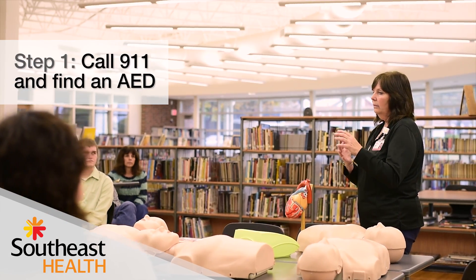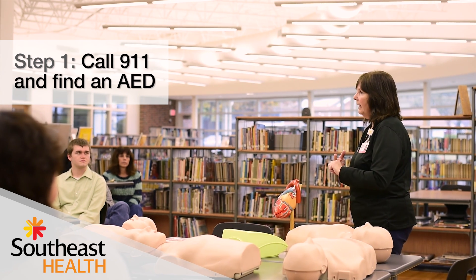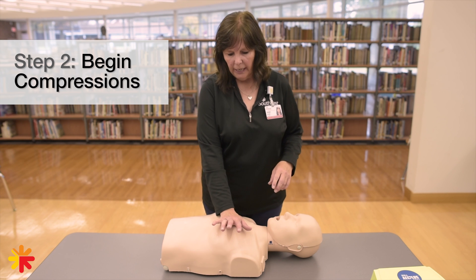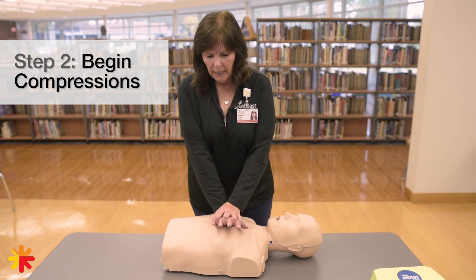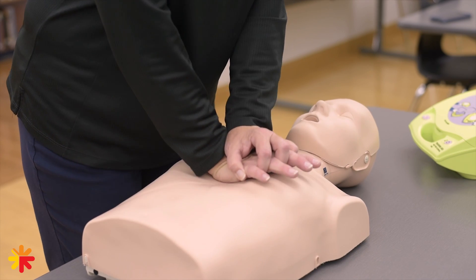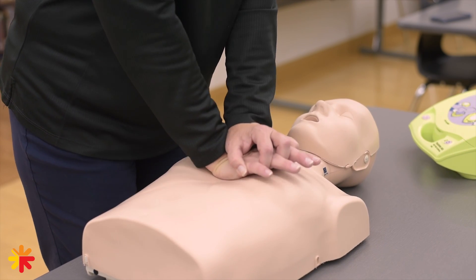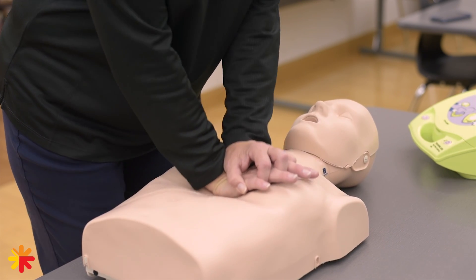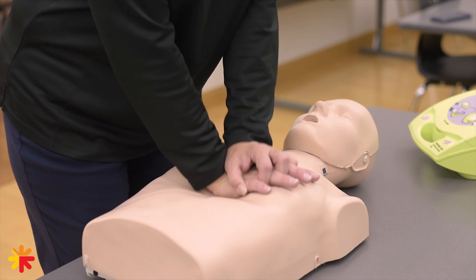And if you're in an area where there is an AED available, tell somebody to get the AED. Then you put your hand on the middle of the chest — the bone in the middle of the chest — both hands over the top, and you're going to use straight arms to push at this pace. Continue that until an AED arrives or EMS arrives.